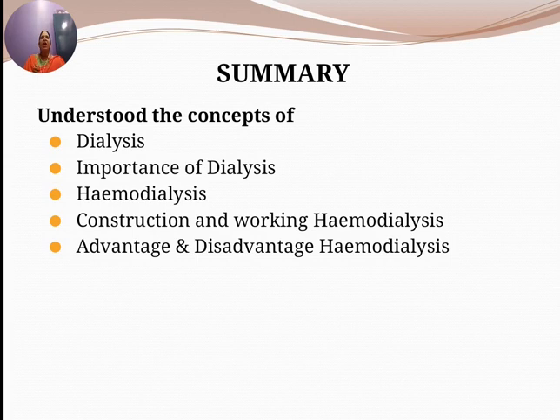So in hemodialysis, blood is allowed to flow a few ounces at a time through a special filter that removes waste and extra fluids. The clean blood is then returned back to the body, removing the harmful waste and extra salts and fluids. So it helps to control the blood pressure and keep the proper balance of chemicals like potassium and sodium in the blood.